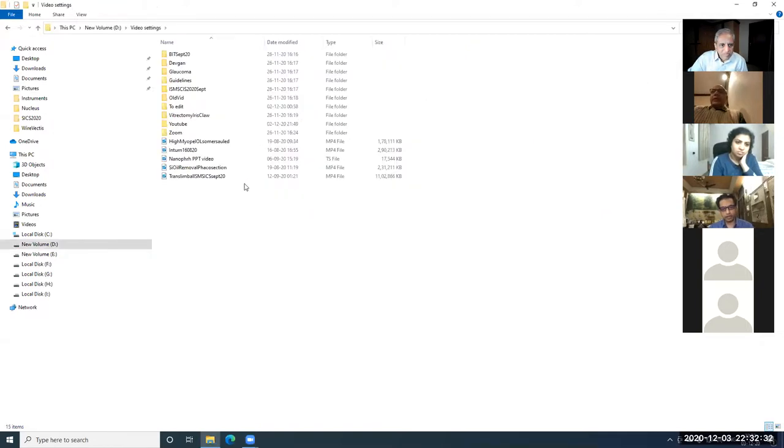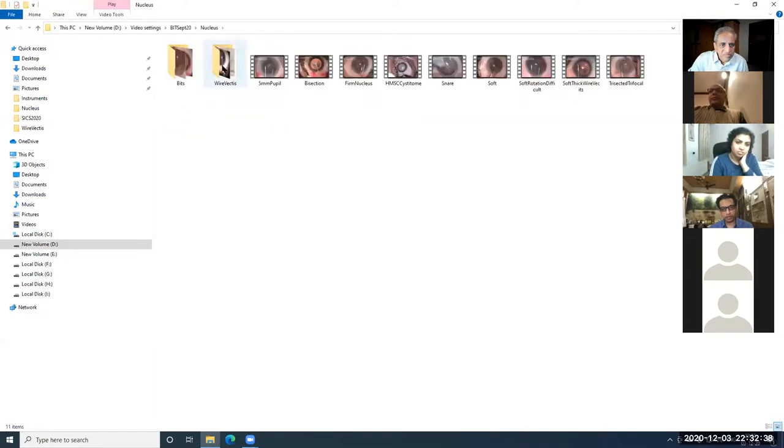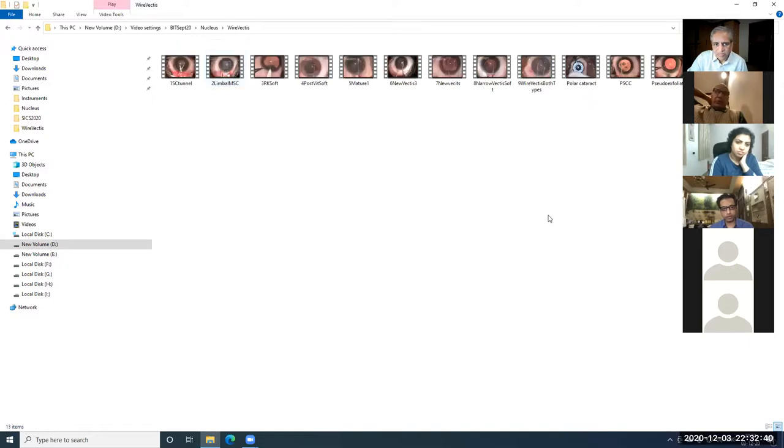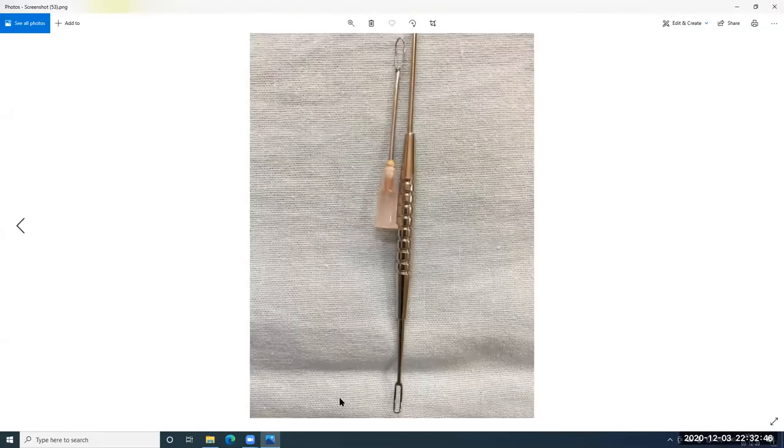Particularly while putting an IOL, if it is not HPMC, if it is, let's say, sodium hyaluronate, I tend to get a feeling that it is not passing through so easily as against HPMC. Definitely, sir. The feel is slightly different, but the chamber maintenance is exemplarily good there. That is what is rock solid.